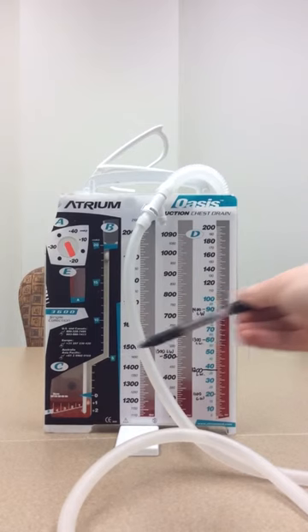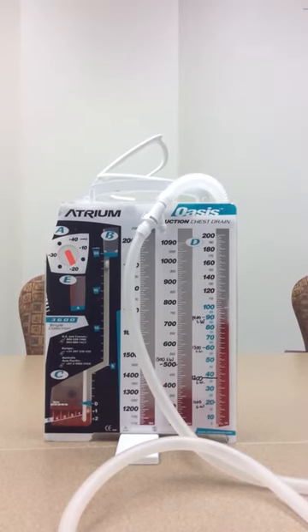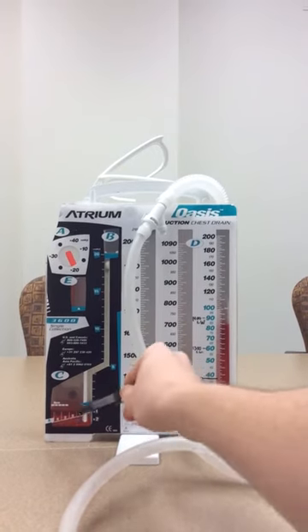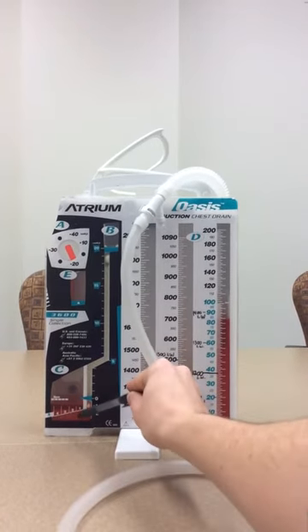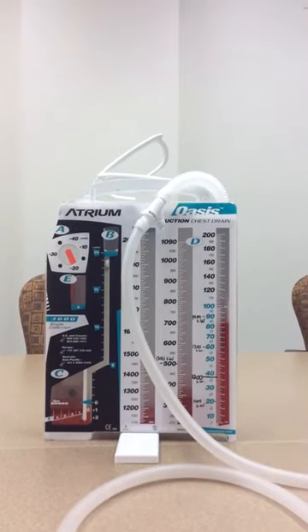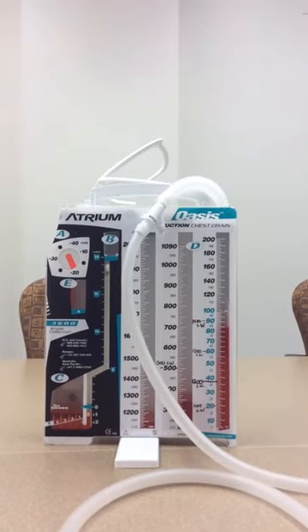Bubbling is okay as long as it's intermittent bubbling with forced expiration or coughing. If it's continuous bubbling, you'll see bubbling come up to one or two or three, but if it's continuous bubbling, that means there's a compromised system where there's an air leak.